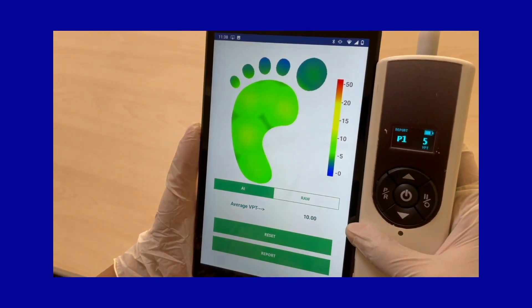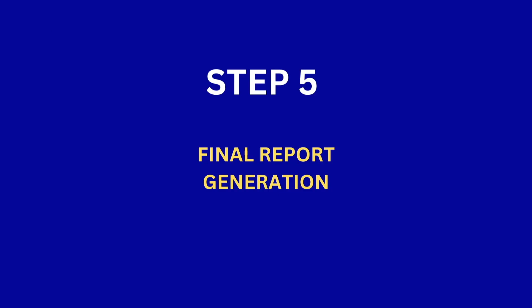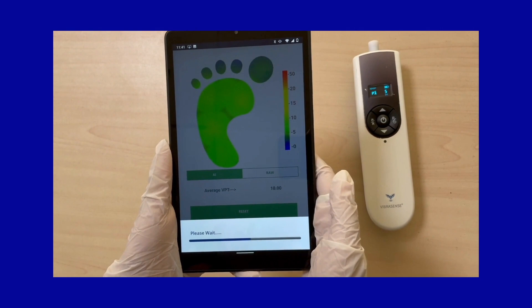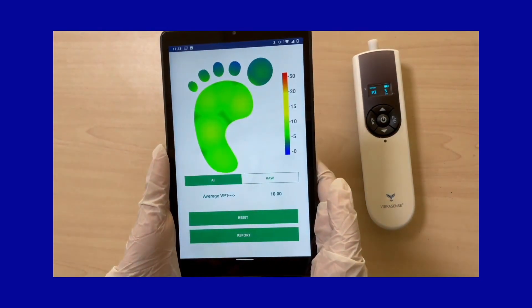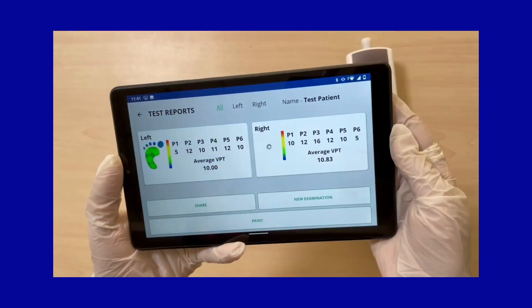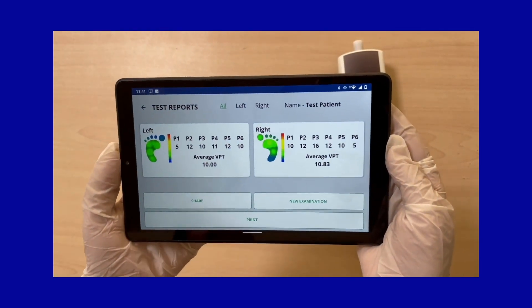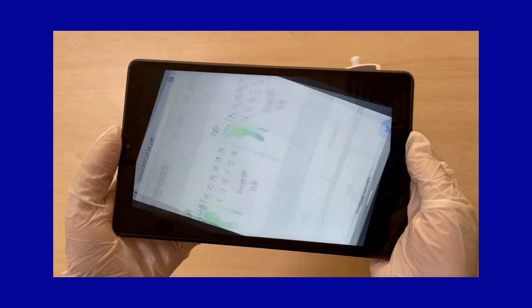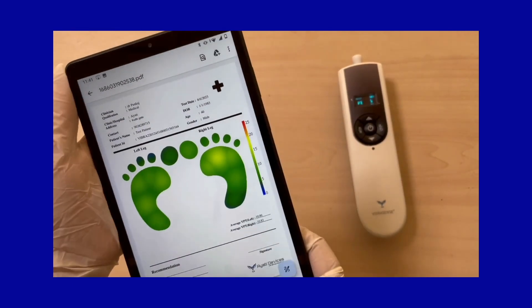Step 5: Generation of the final report. Click the report button in the app screen to generate the final report of both feet. To generate the PDF report, click on the print button. You can share this PDF or print this report using a color printer.